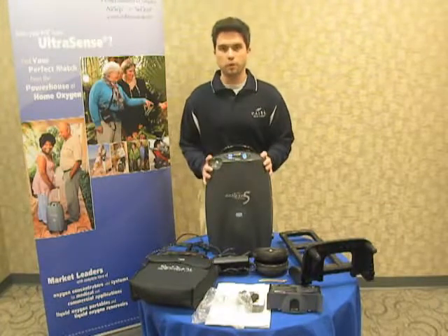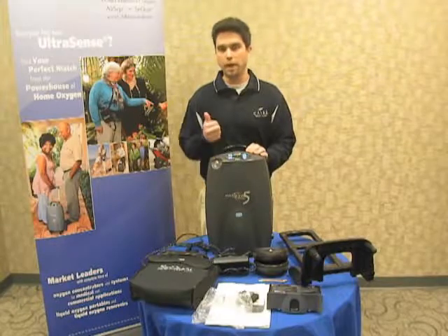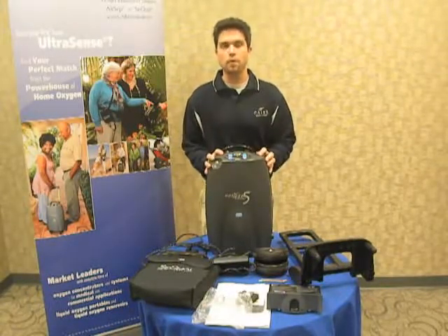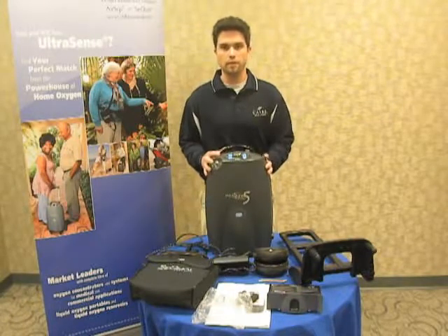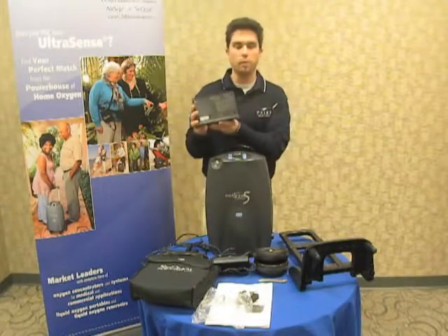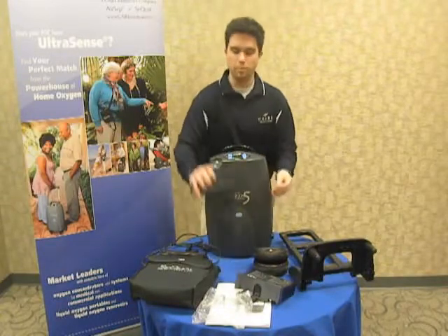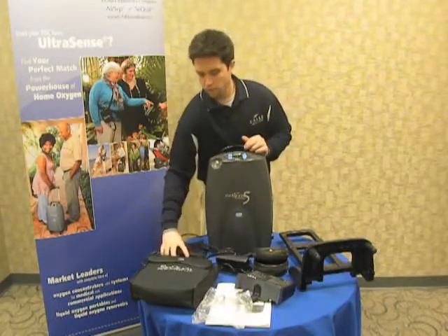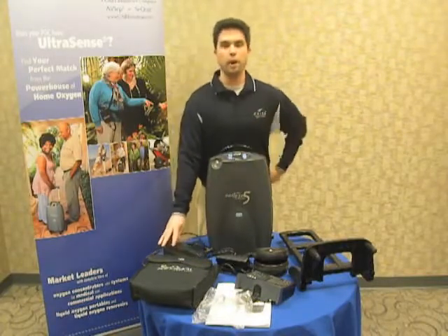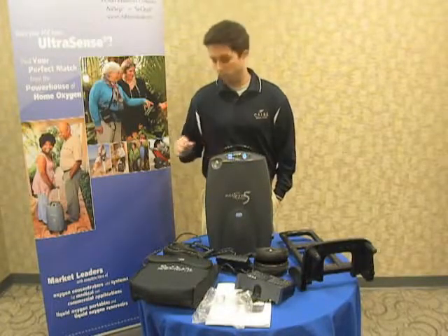Also inside of the box with your Eclipse 5 are your three power supplies. The Eclipse will run off of battery power, AC power, which is plugged into a unit in a house, and DC power, which is plugged into an accessory outlet in a car. Each Eclipse 5 comes with one battery cartridge, as seen here. It also comes with a DC power supply for the car and an AC power supply for home use. Both AC and DC power will recharge your battery cartridge as well as run the unit. We'll talk about that a little bit more.